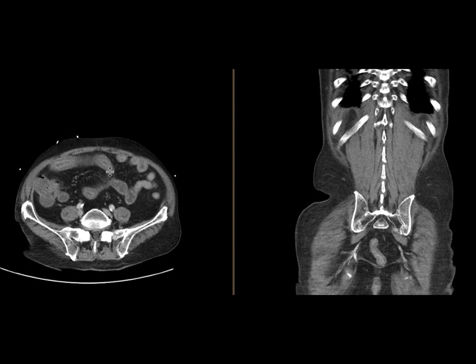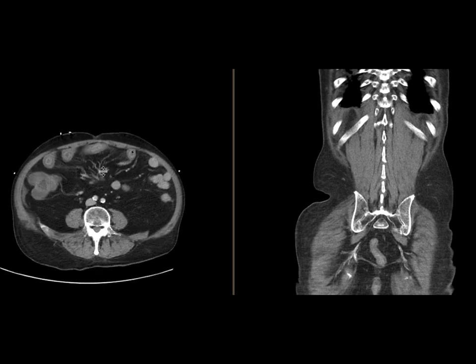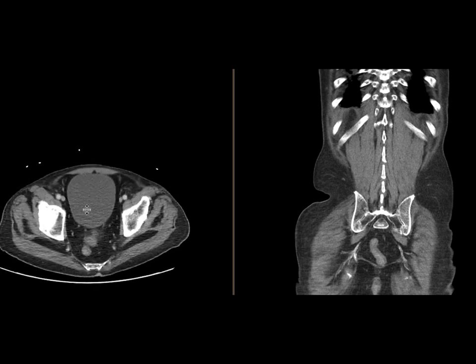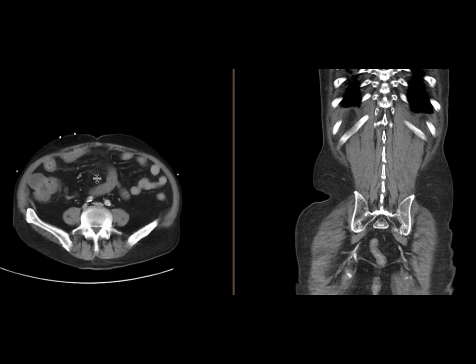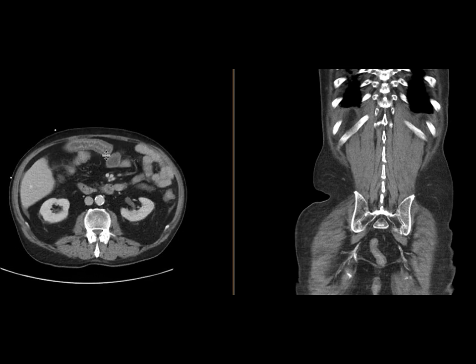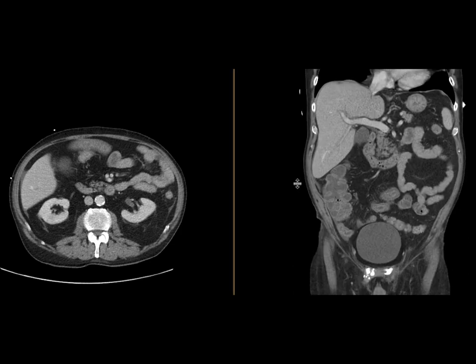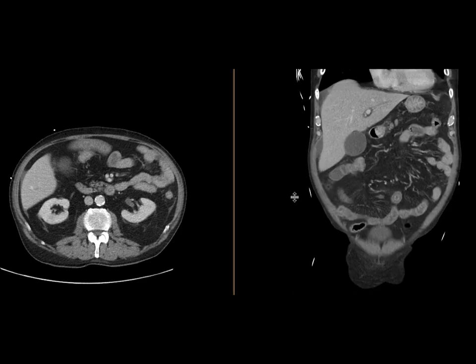Taking some of these loops, they are thickened and have submucosal edema. There is also a little bit of fat stranding and intermesenteric fluid as well. We can see that beautifully on the coronal images as well.